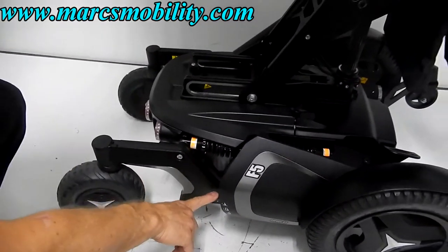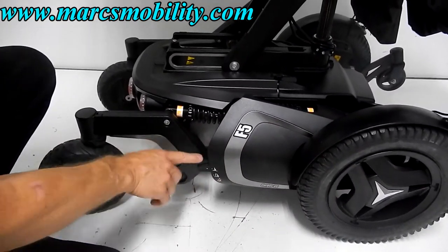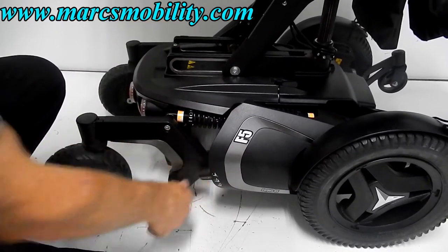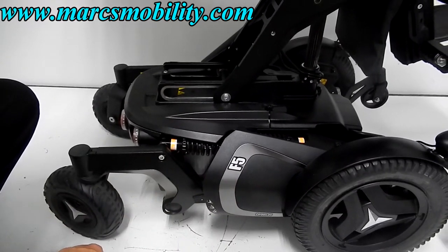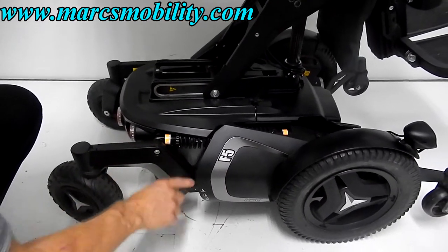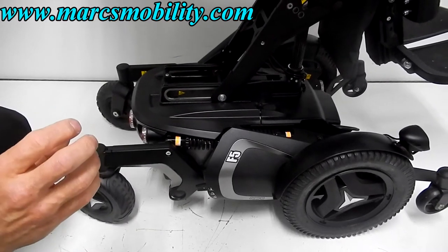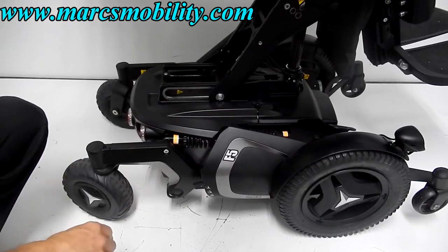The chair has two motors, one for each wheel. To put it in neutral, there's a lever behind each motor — push it down to go into neutral, push it back up to go back in gear. If you need to push the chair, push both levers down. Make sure the power is off when you put it in neutral, or you'll get some resistance.